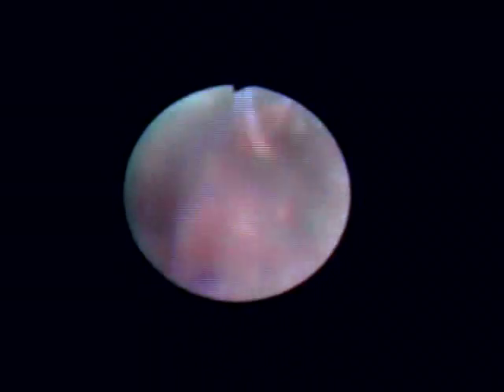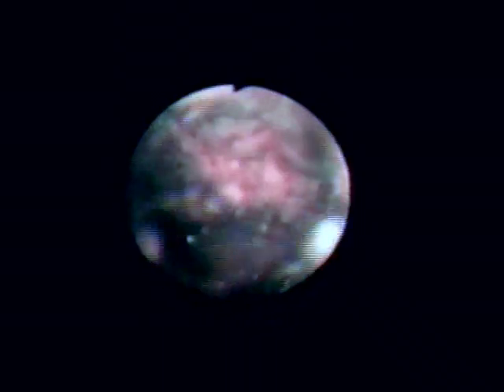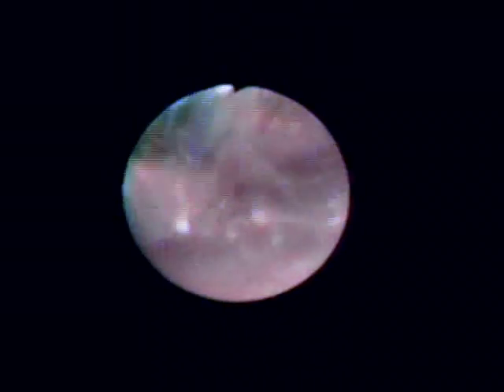For EHL, the metal tip or probe should be targeted on the surface of a stone, and firing should be done only after appropriate location of the tip. The intensity and frequency of shock wave can be modified according to the hardness of the stone.